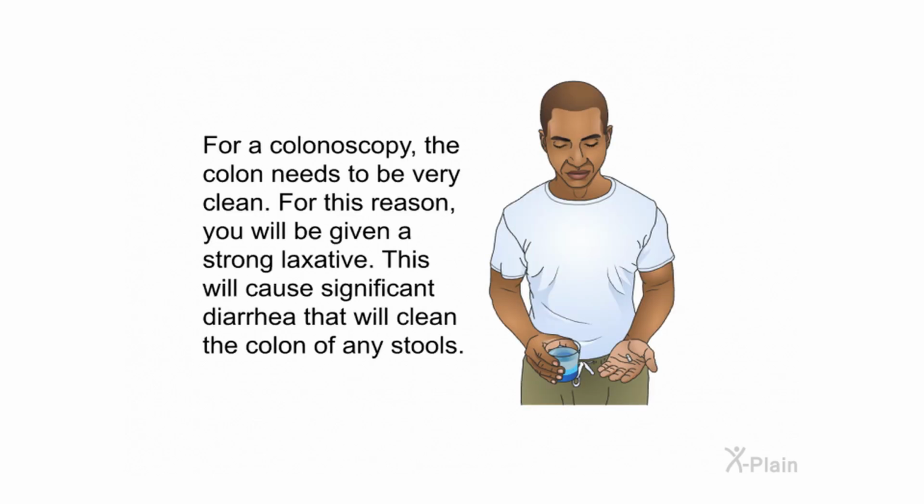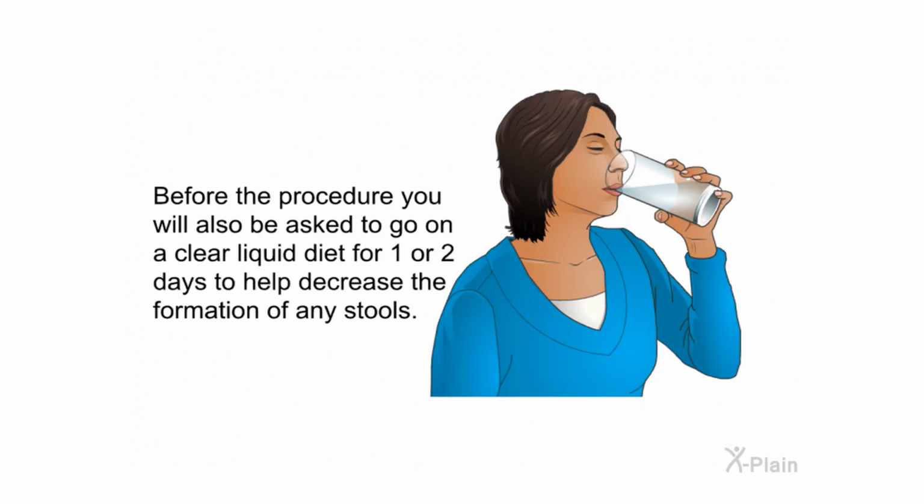For a colonoscopy, the colon needs to be very clean. For this reason, you will be given a strong laxative. This will cause significant diarrhea that will clean the colon of any stools. Before the procedure, you will also be asked to go on a clear liquid diet for 1 or 2 days to help decrease the formation of any stools.